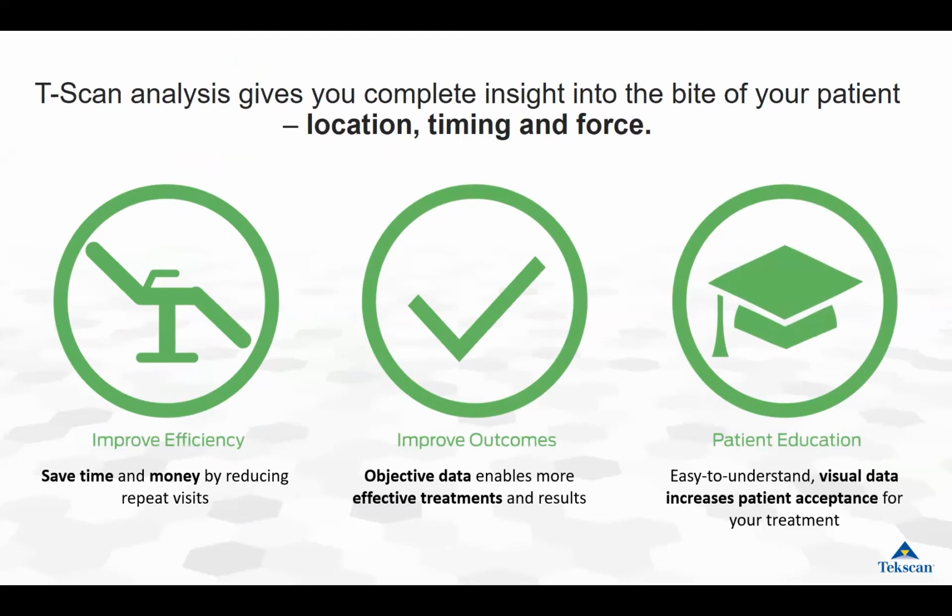So as a dentist, who doesn't want to obtain the best outcomes possible for their patients? Of course you do. We know that isn't even a question. Our hope is that you strongly consider how T-Scan can help provide you that best possible outcome. And in the process, it's going to make your practice more efficient and engage and educate your patients. When patients can clearly see what's going on in their mouth, it's going to naturally lead to higher case acceptance rates as well.